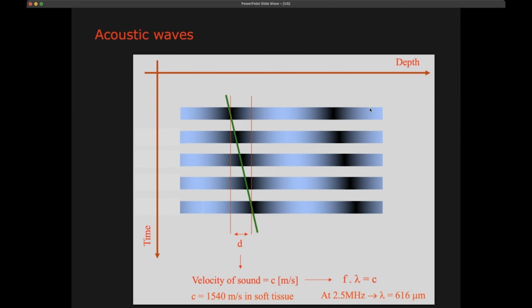So when we look at it as a wave, that means that we have this local oscillation of the medium. But by the fact that you have an elastic medium, if you displace one point, then that one will interact with the next one, and that one will interact with the next one over time. So that means that in the end, this whole wave is also propagated through the object.